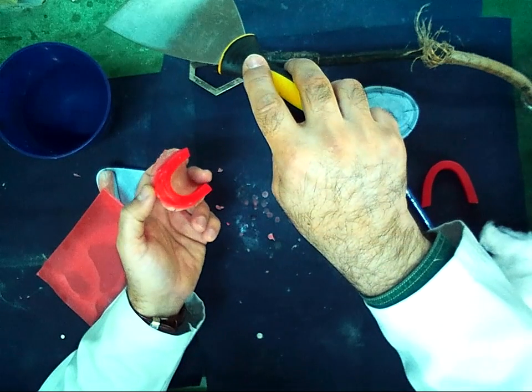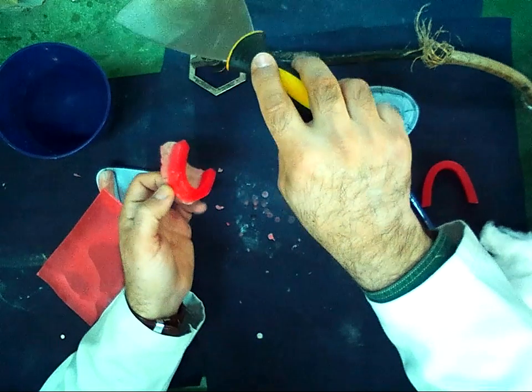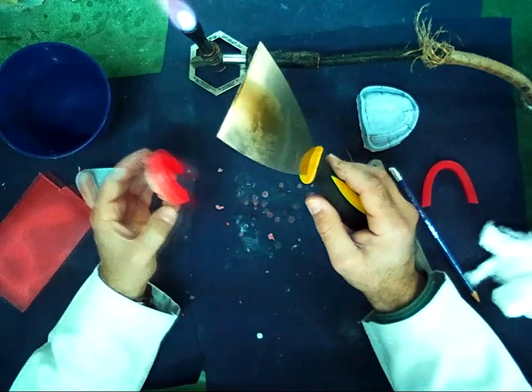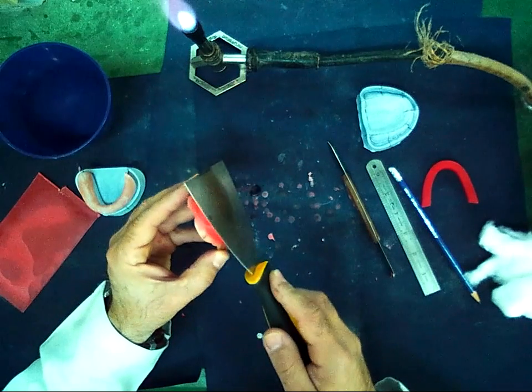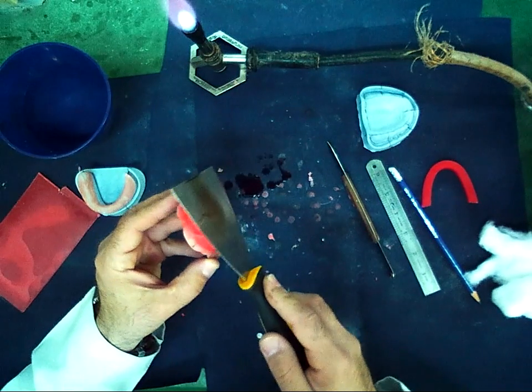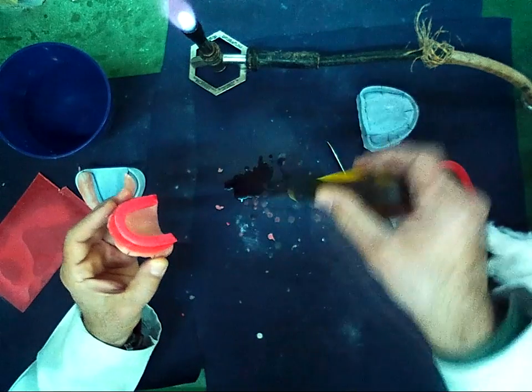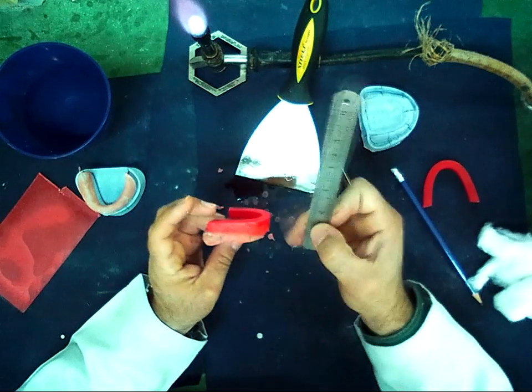But I should be careful not to remove excess material that changes my measurement. I put it directly on the occlusal plane, and then remeasure the anterior and posterior part.